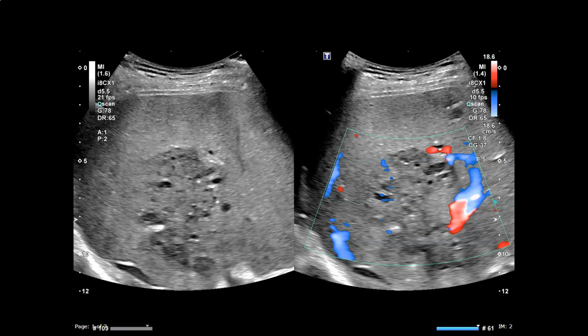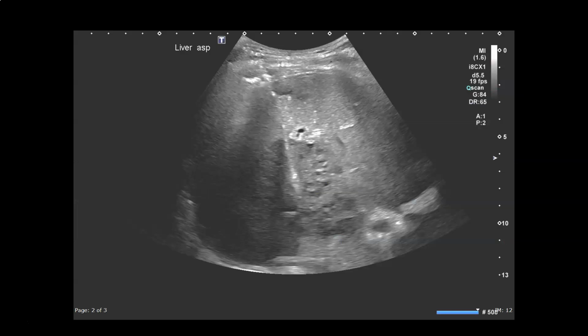The point here is that this ultrasound has been done quite a good time after the onset of fever, and the abscess is still having more solid components than fluid components. Ultrasound guided drainage of the abscess has been done, and it yielded a very small amount of pus. Based on the purulent material taken from the lesion, the diagnosis of abscess is established.